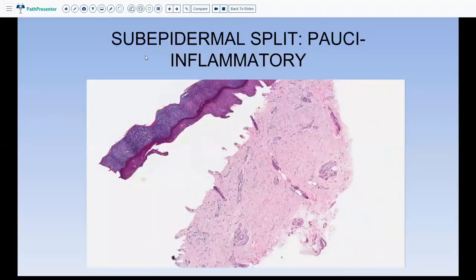In the first category — sub-epidermal split that is pauci-inflammatory with very little inflammation — your differential diagnosis narrows down to either PCT (porphyria cutanea tarda), epidermolysis bullosa acquisita, or cell-poor bullous pemphigoid. Once you have decided, your list is very short.